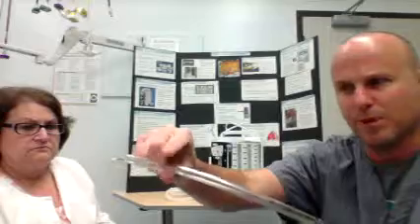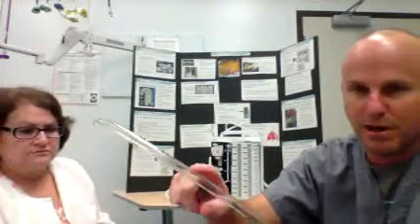If we just had one hole, it could get occluded, or it could pull the lung tissue up against it. So that's why there are many holes. And when the provider inserts this, he will make sure that this very last hole, the most proximal hole here, will be covered up and actually inside the patient. If not, you'll have a big air leak, and we'll discuss air leaks when we get into troubleshooting and complications. This is the end that will be sticking out of the patient.